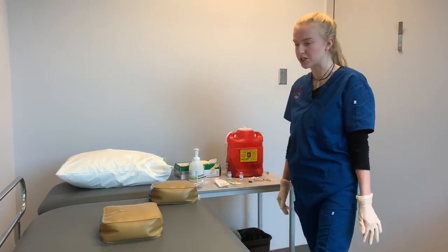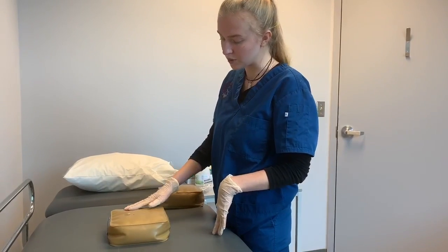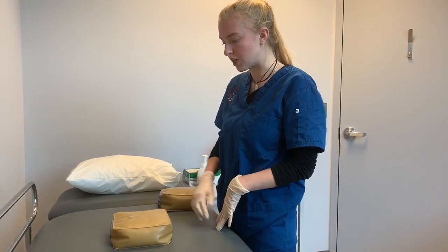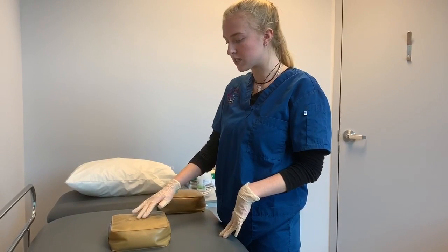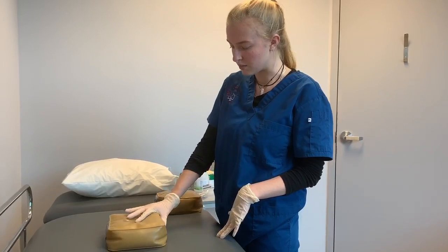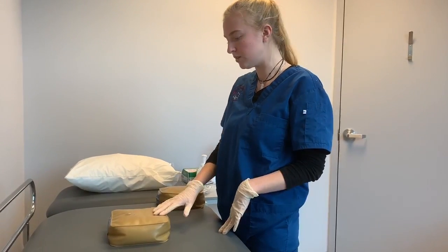Before doing my injection, I'm just going to inspect my patient's skin. So upon inspection, I don't notice any lesions or masses. I noticed that the nurse before me did the injection on the right side, so I'm going to do it on the left side because there's no bruising here. For landmarking purposes, I'm going to do the injection 2 inches away from the navel, and I can pinch about 5 centimeters of the skin, so I'm going to put the needle in at a 90-degree angle.